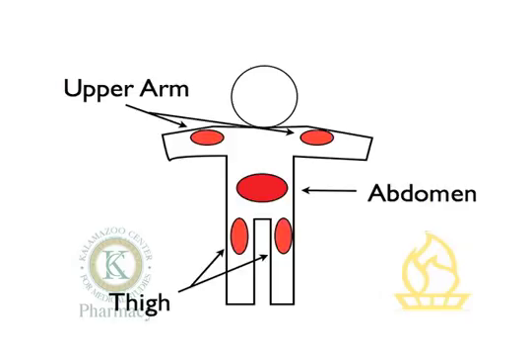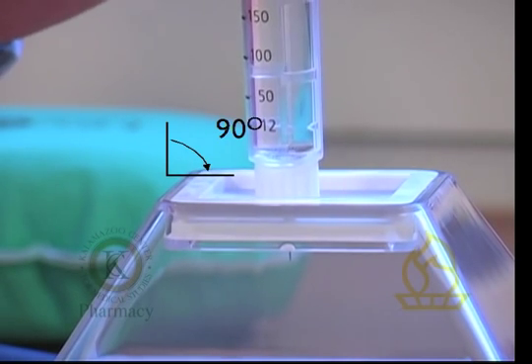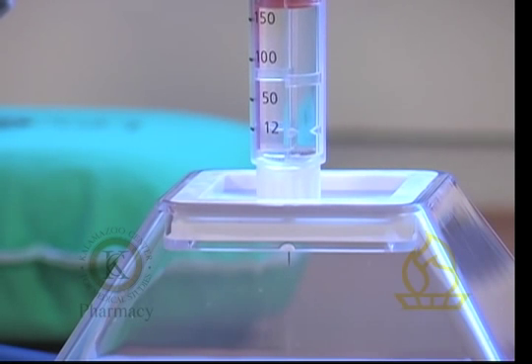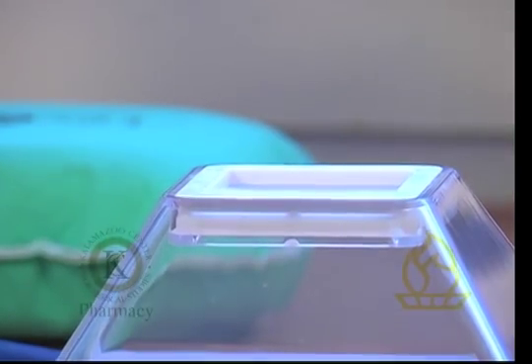When injecting, pinch about an inch of skin and inject at a 90 degree angle. For the purpose of this video, we will not be injecting into an actual person. Be sure to hold the flex pen in place for about six seconds after the dose is delivered. Remove the needle from the injection site.